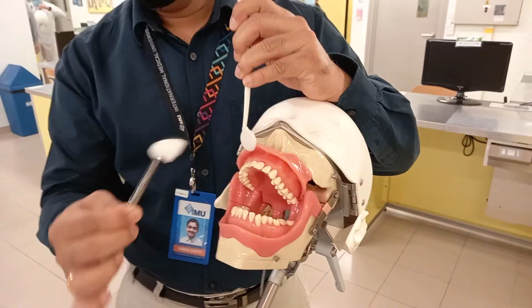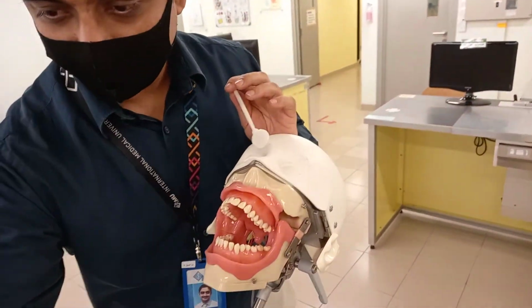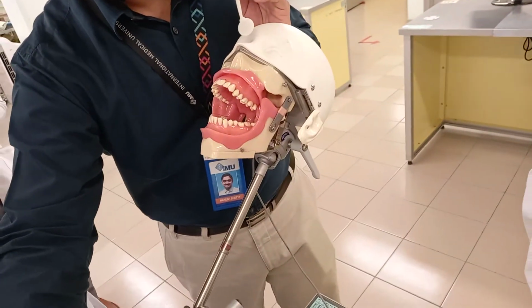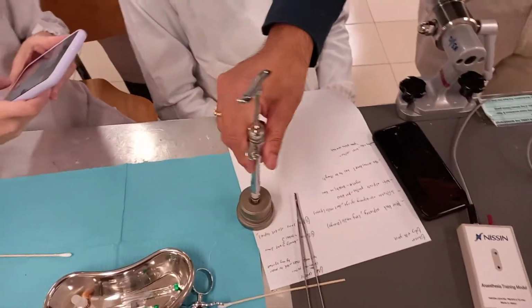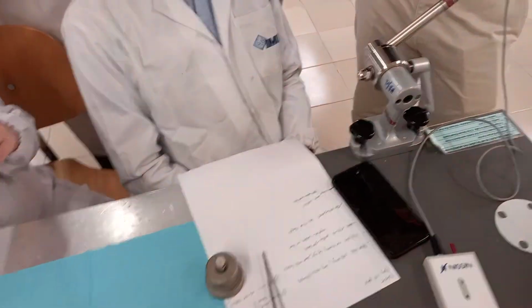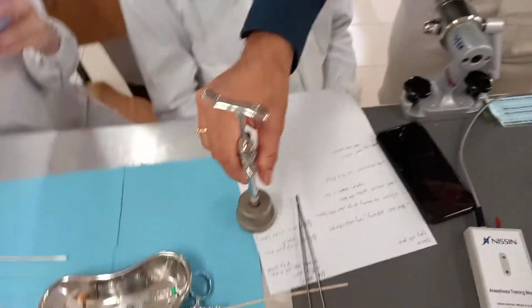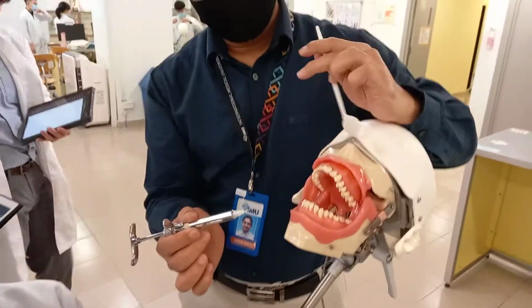You can do it here. Then throw this. Then you take this, it has to be on that. Here. So this will be like this. You just do like this. Don't do like this, because it will get bent. If it's not coming, just ask your assistant to hold this, and then you slowly rotate it. Then you can retract.